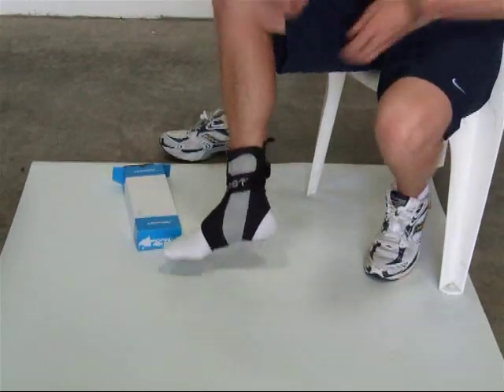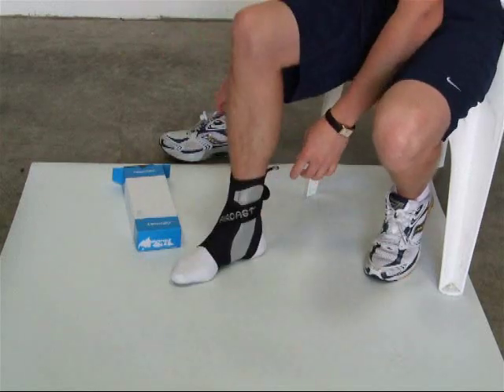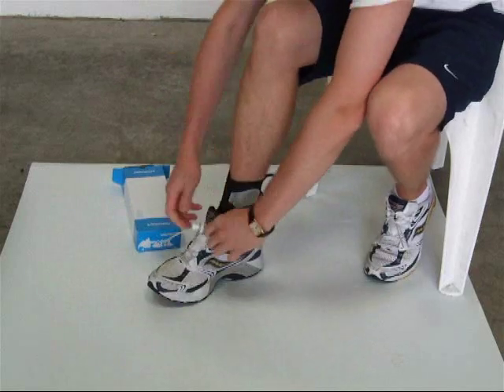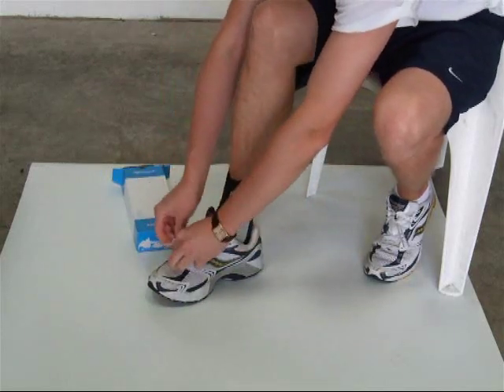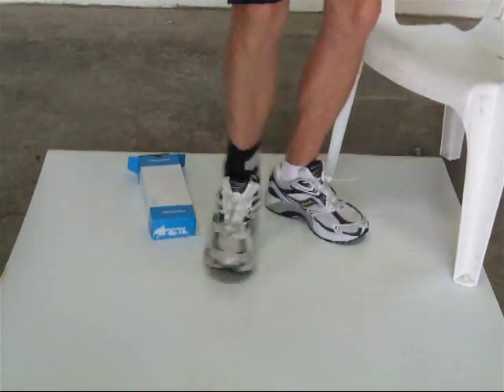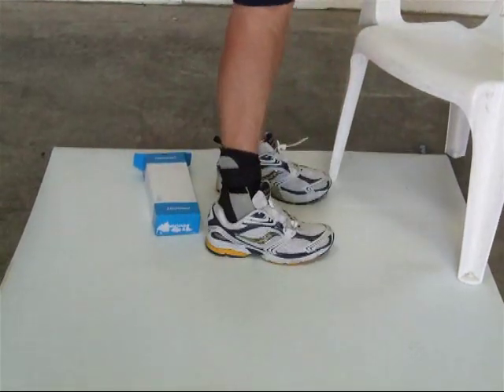The Aircast is very lightweight, very slim, so it's easy to get your trainer on and will allow you to play sport without even noticing you've got it on.